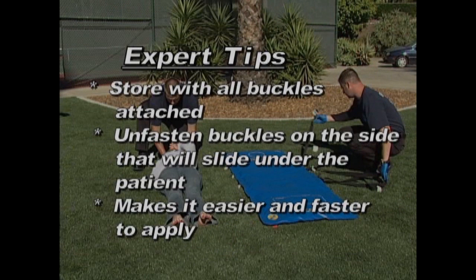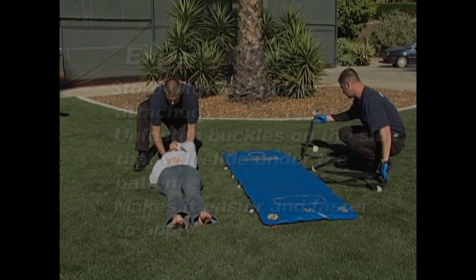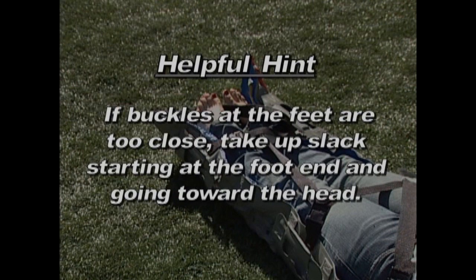You may find it helpful to store your vacuum mattress with all the buckles attached, and then unfasten only the buckles on the side of the mattress that will be slid under the patient. This should make it easier and faster to apply the mattress. If the buckles at the foot end are very close together, it may be easier to remove any excess slack by tightening the strap in the reverse direction, moving from the foot end toward the head end of the patient.